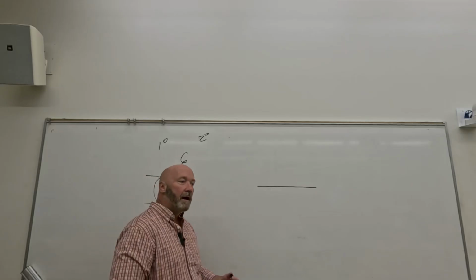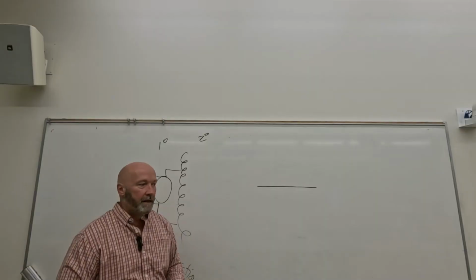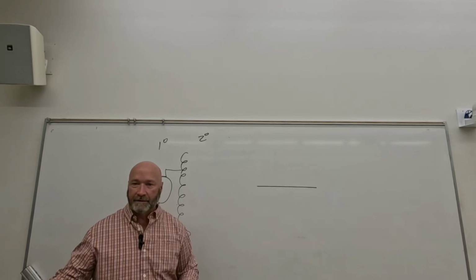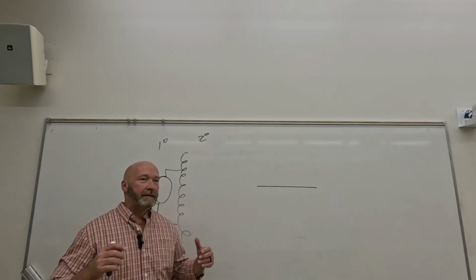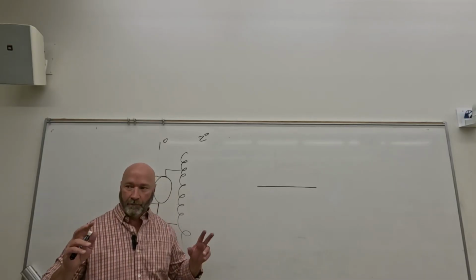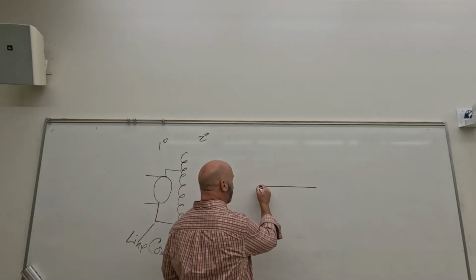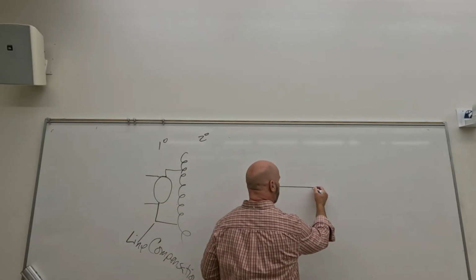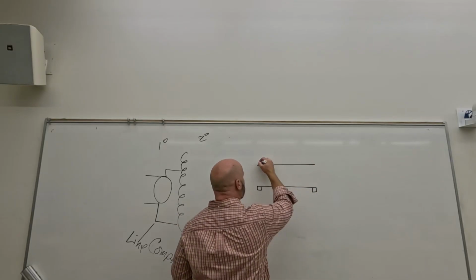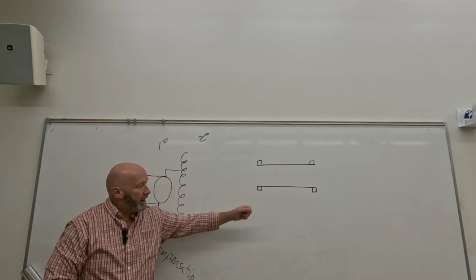The other type of tabletop, Bushong refers to as curved. I'm going to show you a picture here in a minute. It could be curved, but those are usually a special application type tabletop. The radiography rooms or RF room tabletops that we refer to as curved aren't really curved. It's just that the bracing that would be underneath on a flat tabletop is not underneath. Instead, it's over the top like that. So our lab equipment is like that.